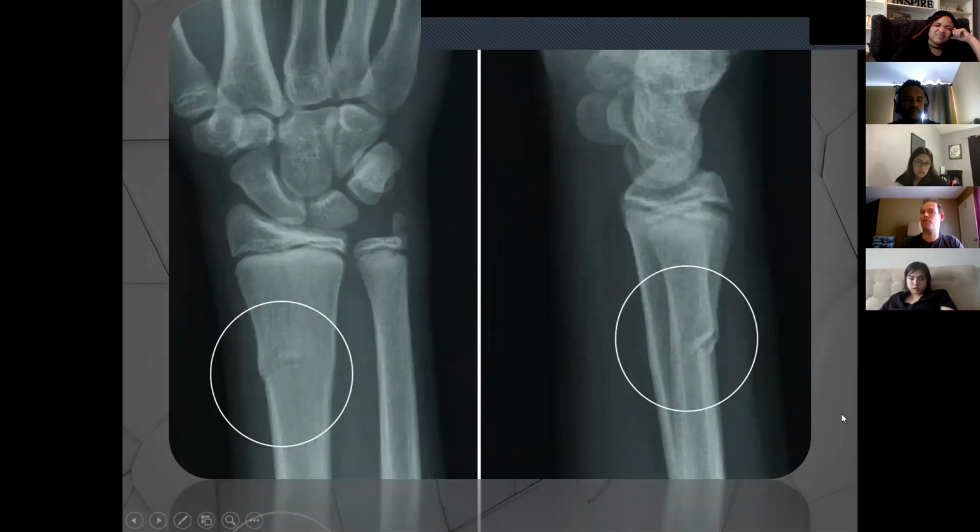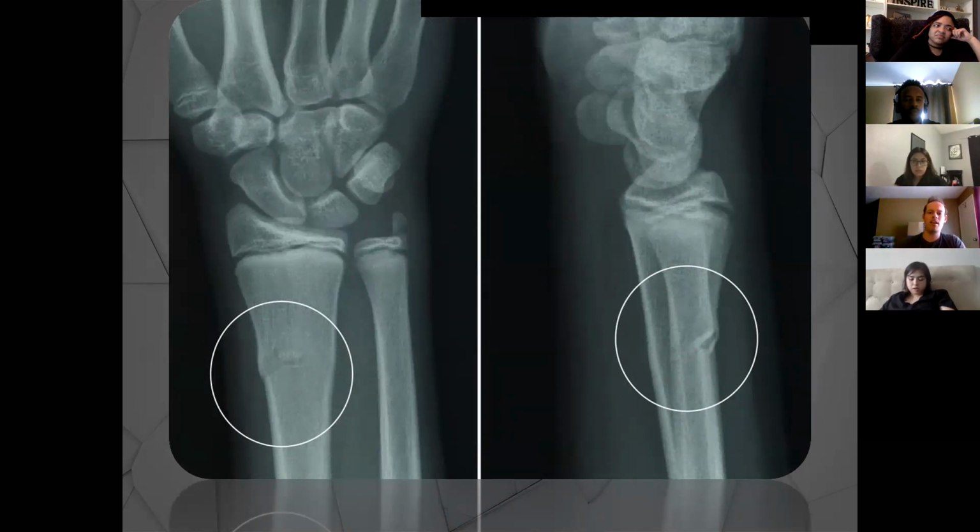And this is what an actual fracture would look like, guys. You will develop this as you move on. You'll develop the eye for this, but a fracture is going to be more distinct in the way it's shaped, in the way the bone actually splinters apart. And also, most of the time, it's not going to be that close to those growth plates. Most of those fractures will be more distal or proximal to the actual broken location.